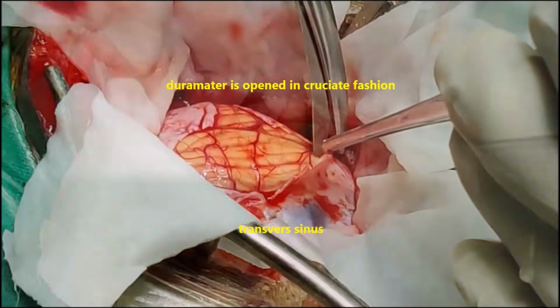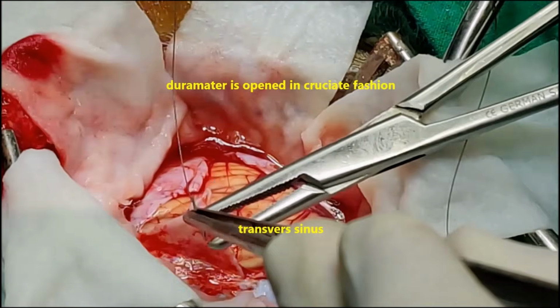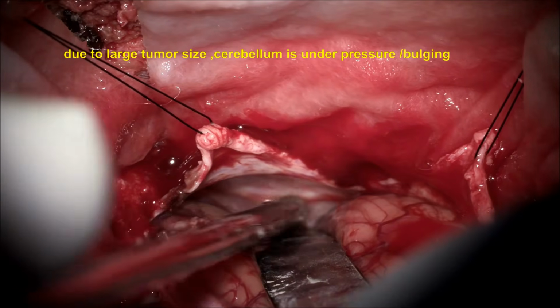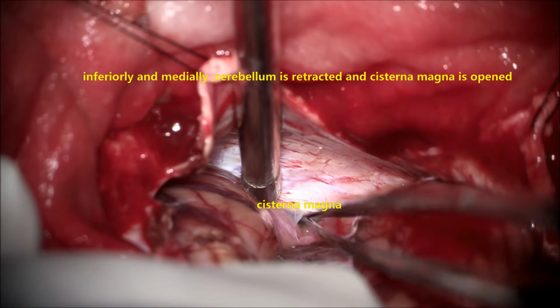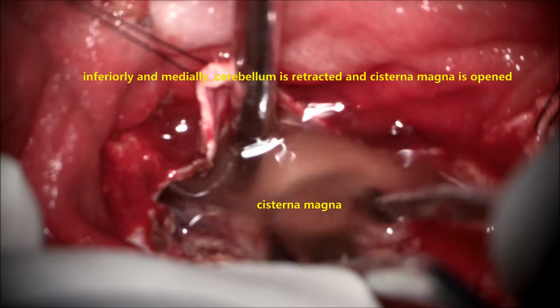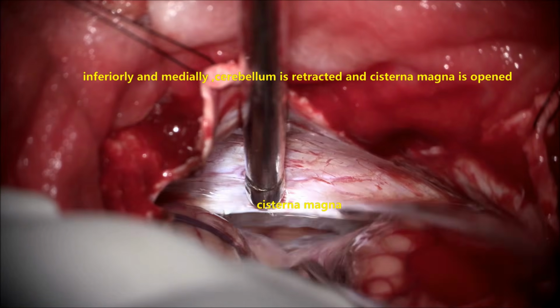Once that is done, the dura mater is opened in a cruciate manner. Now I want you to see here the cerebellum is bulging because of the large tumor. In these situations we prefer to open the cisterna magna and let out the CSF so that the cerebellum gets relaxed. Inferiorly and medially, gently, the cerebellum is retracted. We reach the cisterna magna, and it has 2 layers of arachnoid.